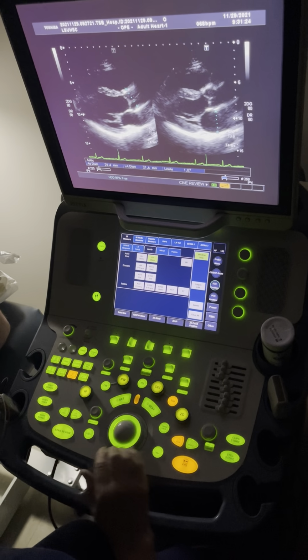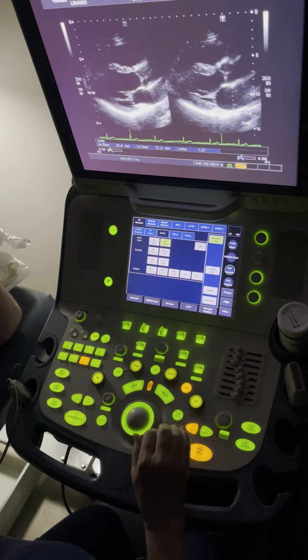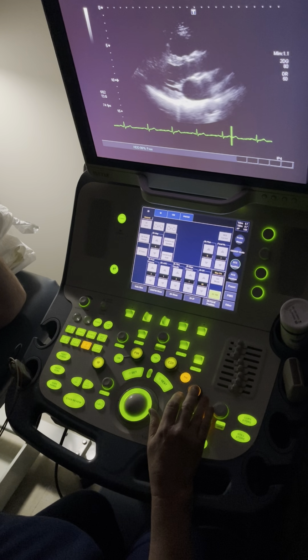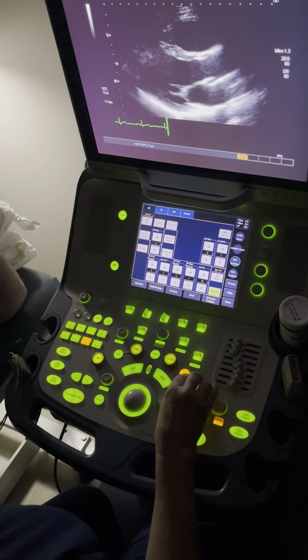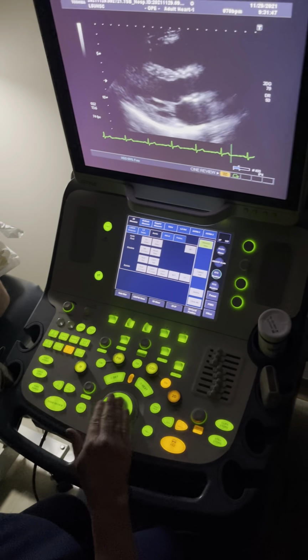Okay? I can do the same thing. So now I would want to do LV outflow tract. Again, sometimes you have an image that you can do it all at the same time, and if you can, you should take advantage of it, okay? If I want to zoom, I can. I'm not going to zoom too much. Have a nice image.